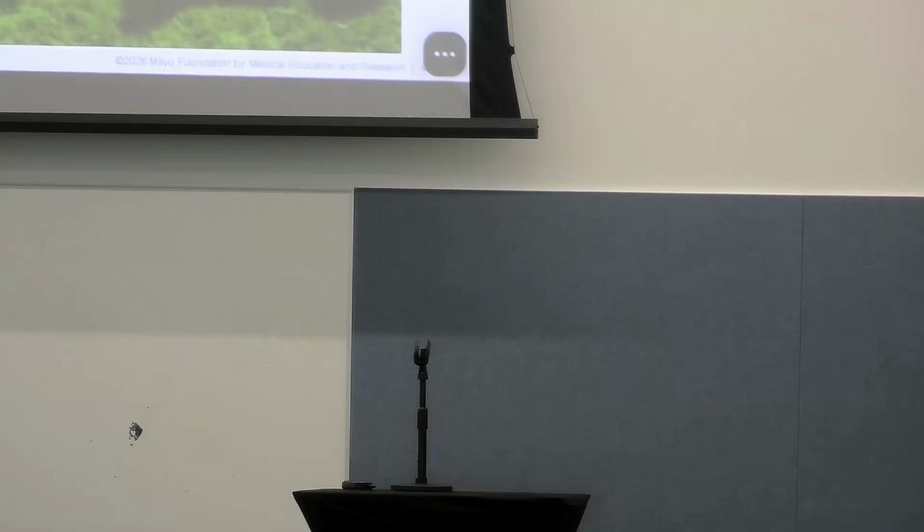Great presentation. I have a question on the value or the results of PYP in AL amyloidosis. How often is the PYP positive? And second, associated question: if it is positive, is it usually grade 2 or 3, or if you have a grade 3, is it less likely to be AL?